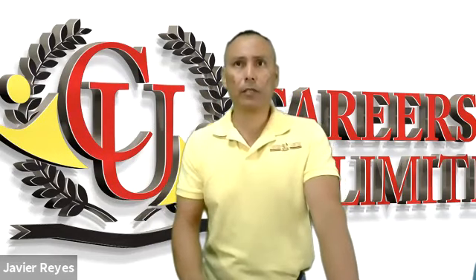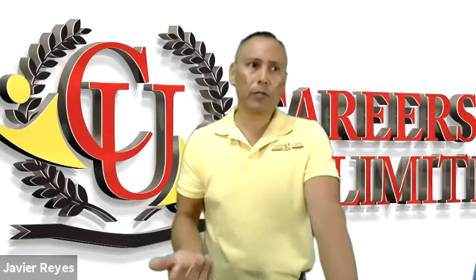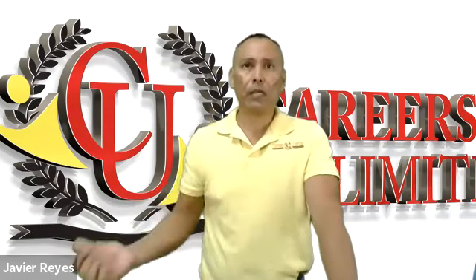Hold pressure over the site without restricting their movement. Remember, sometimes if the patient has convulsions, they may be moving their arms back and forth, and they may injure themselves. So if they do tell you they have a history of seizures, they're best served in a bed, or at home it would be on their couch or a reclining chair. But you have to make sure that their arms do not get stuck anywhere within the chair.